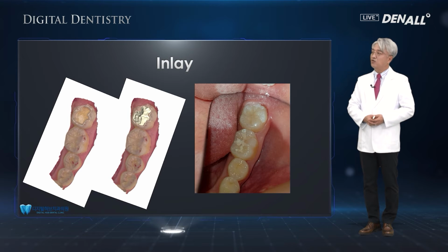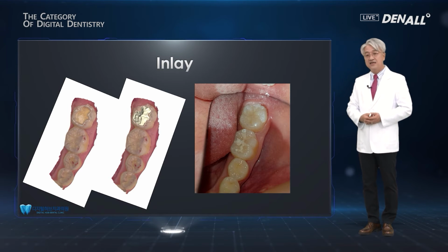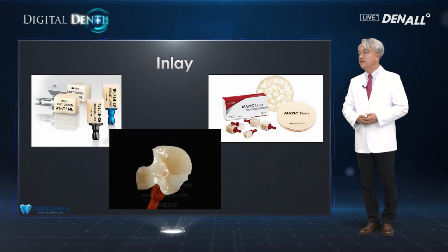So number 37, it fits well, and as an inlay, it's something that I always recommend to be the first treatment to use with CAD/CAM if you're just starting off, because it's very easy to do compared to other things. So I recommend you start digital dentistry with inlay.